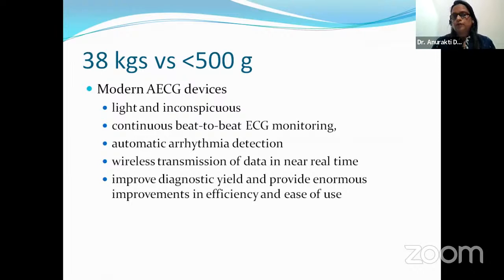We all know that modern devices are very light and inconspicuous. No one will know that you're wearing them and you can go about your day-to-day activities. That has helped in prolonging the time of recording from 24 hours to 48 hours to now 3 to 7 day recording, sometimes 2 weeks or 4 weeks recording as well.